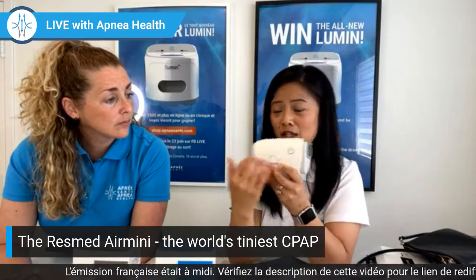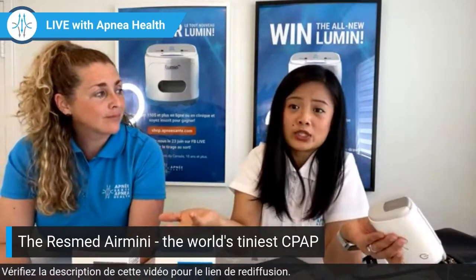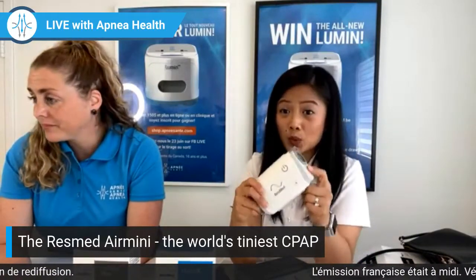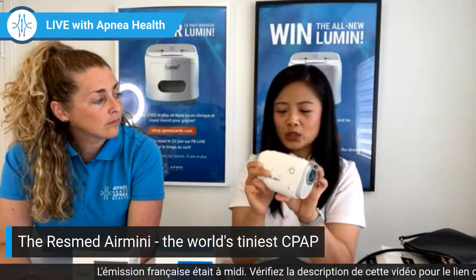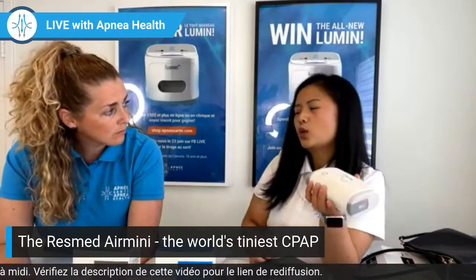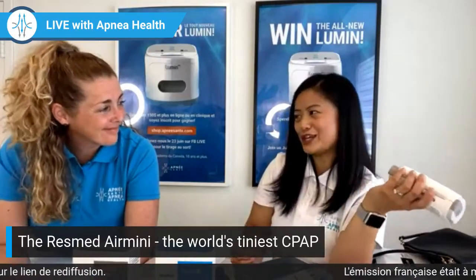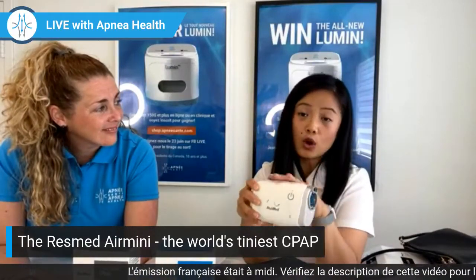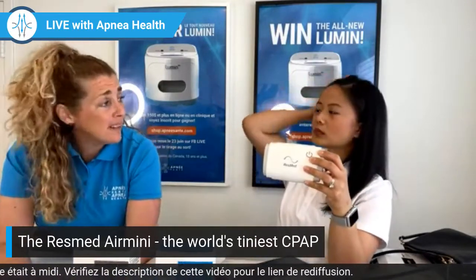You can't access any of these settings. I teach my patients how to access comfort because you know your comfort yourself, so you will have to be able to adjust that. And again, it might be a bit noisier. So for somebody who's starting for the first time, I do not suggest you get a travel CPAP. It's actually not recommended. But for somebody who's retired, who already owns a CPAP for 20 years and travels for half of the year, why not? But you do have to know the disadvantages of this. For somebody that doesn't use their humidifier, that could be a really good option.